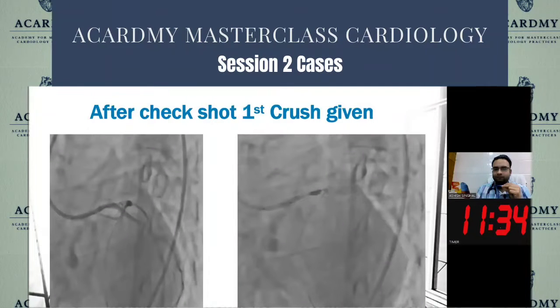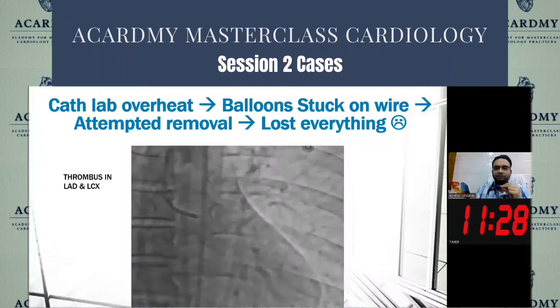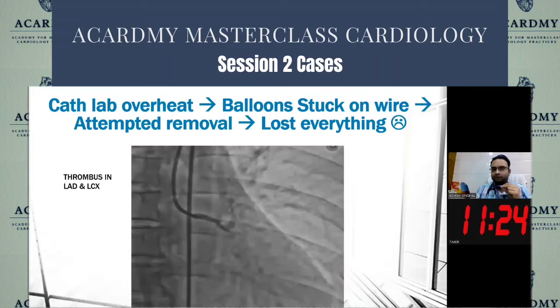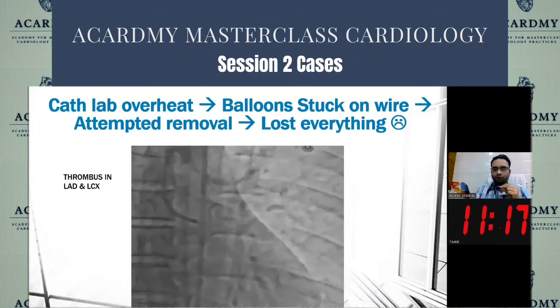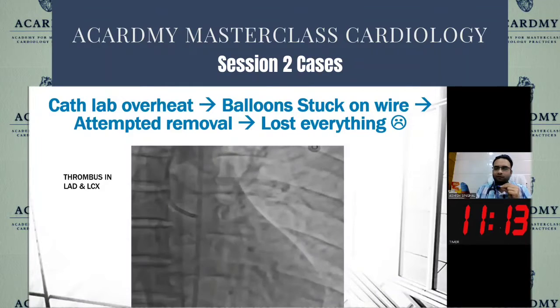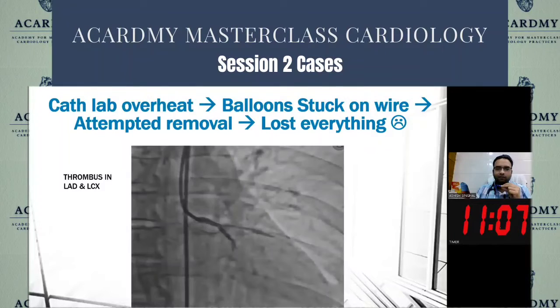By this time, because of the poor quality of our cath lab, it got overheated and we were not able to record fluoro and cine. We were unable to remove the balloons easily from the wires, and during the attempted removal of the balloons from the vessels, there was a complete loss of guide wires from both vessels, leading to a complete loss of control.